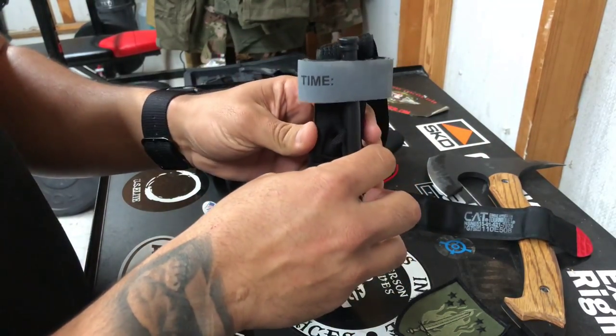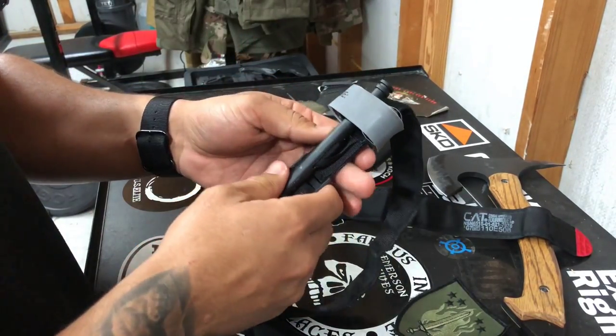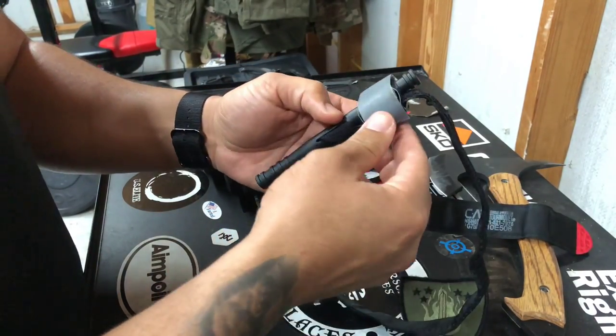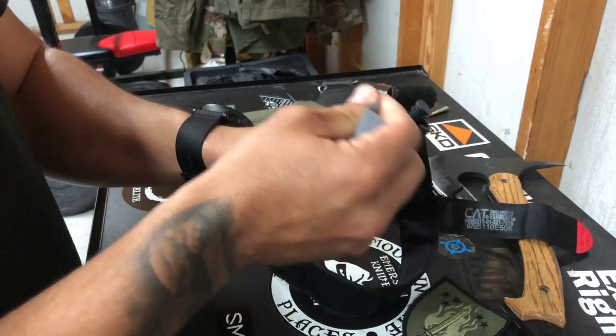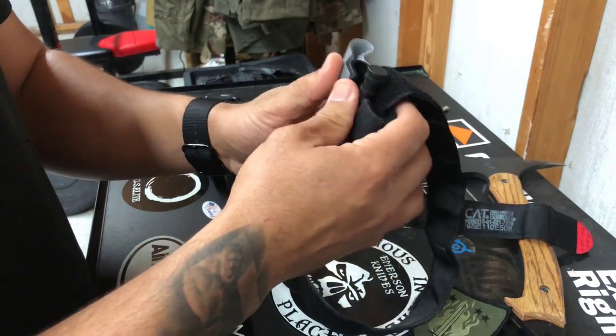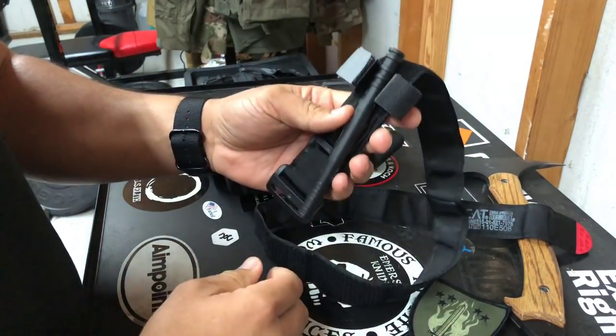I've heard some people say, "It looks better." We're not in the business of looking good right now — we're in the business of saving somebody's life, or maybe even your own. You can actually bleed out pretty fast if you're shot in one of the arteries in the leg, like the femoral. So let's go ahead and make our life easier.